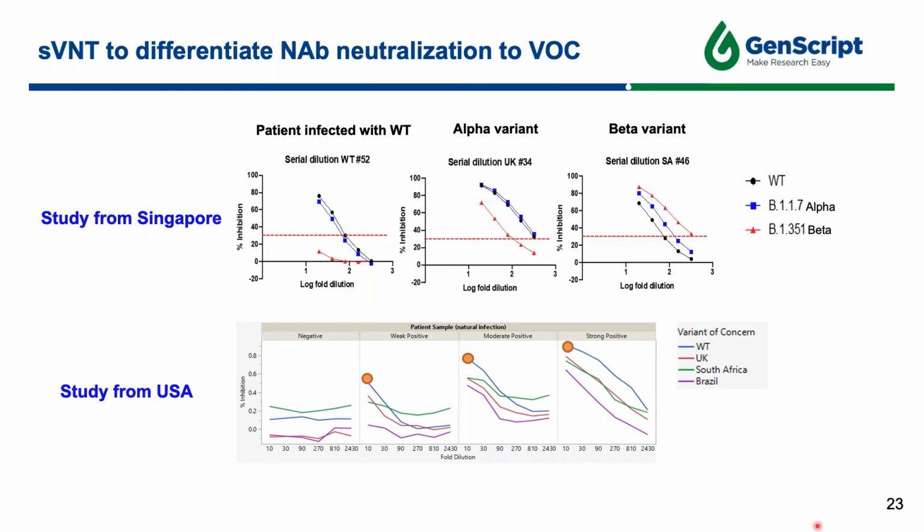For our internal study, we didn't specifically test serum containing abnormally high triglycerides, but when we did our validation for the different sera, we also didn't screen out those that contain high triglycerides, so regular serum works with our assay. And if the serum really contains abnormally high triglyceride, you can still try the assay and see if the quality control is still within the criteria.